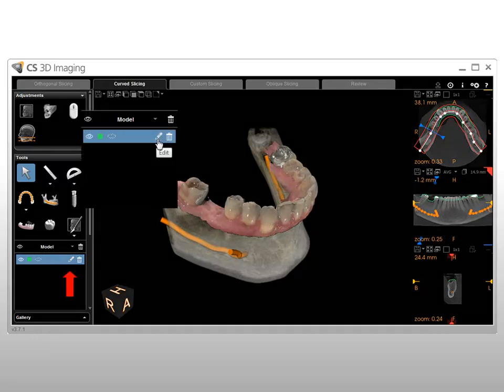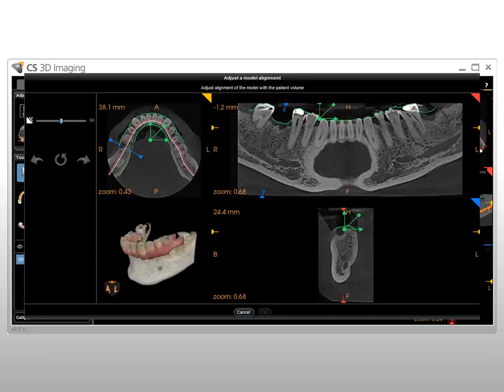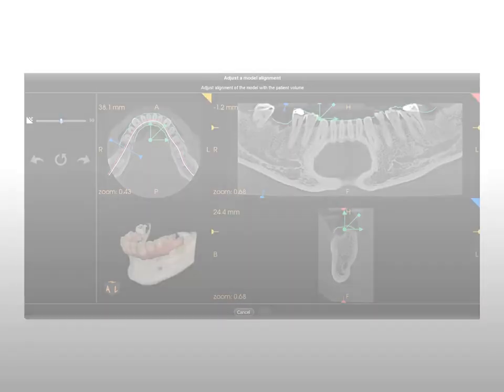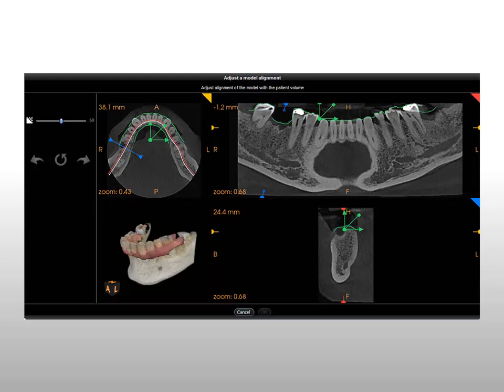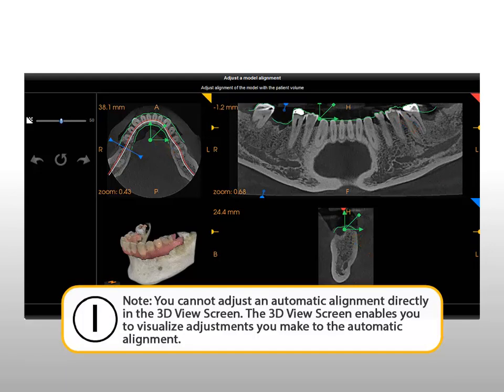Click the pencil to open the Adjust a Model Alignment window and edit the automatic alignment of the model. When you open this window, the aligned model and patient volume are displayed in the 3D View screen, and the outline of where the model's soft tissue meets the slice planes is displayed as a green line in the axial view, reconstructed panoramic view, and oblique coronal cross-section view screens. Note: you cannot adjust an automatic alignment directly in the 3D View screen; it only enables you to visualize adjustments.